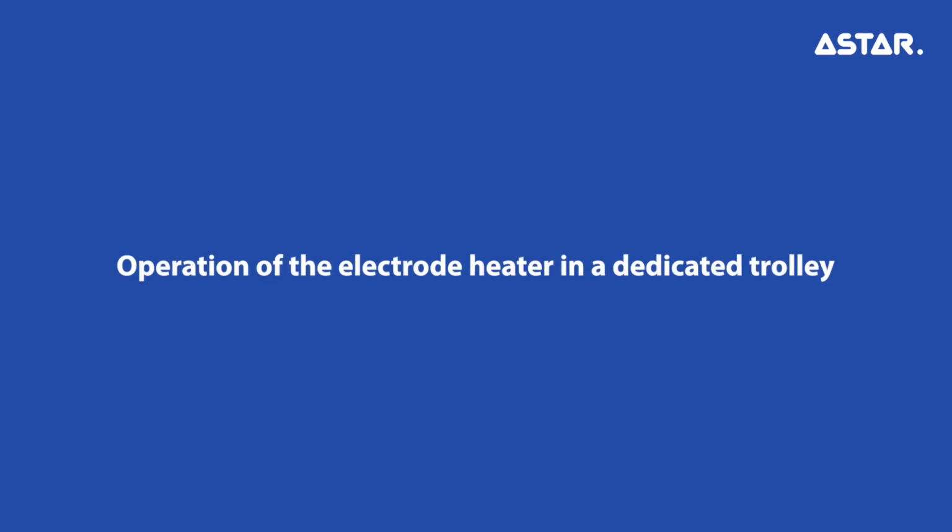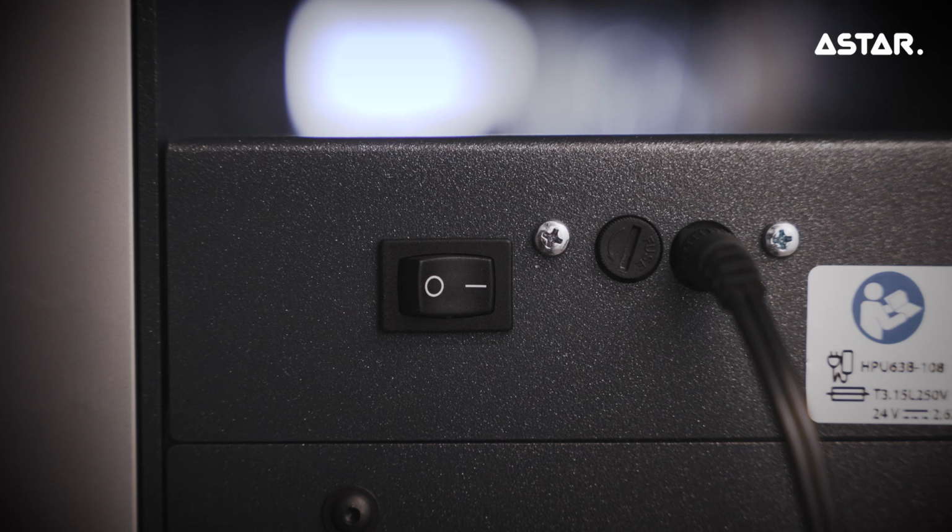Operation of the electrode heater in a dedicated trolley. Switching on the heater.